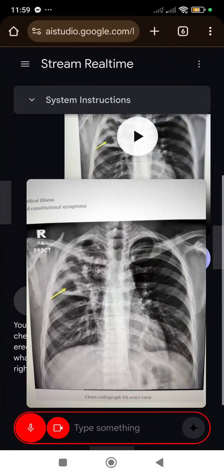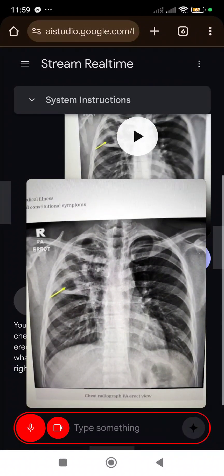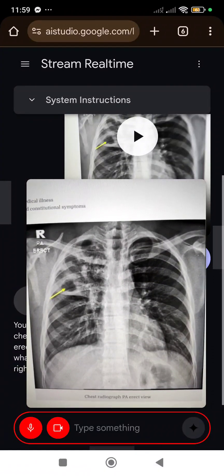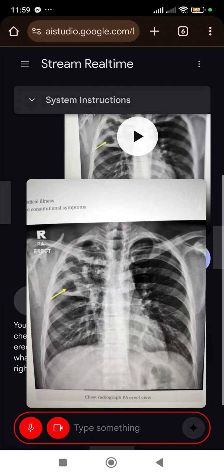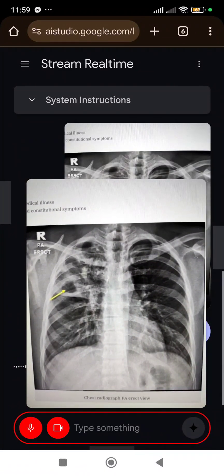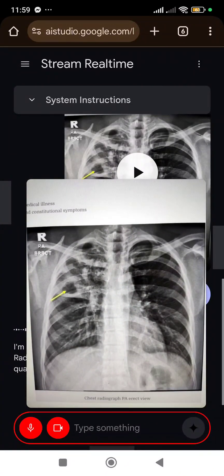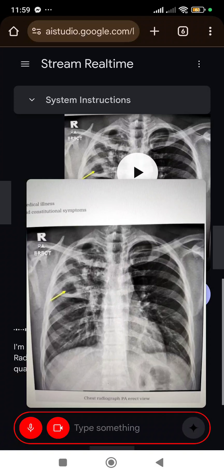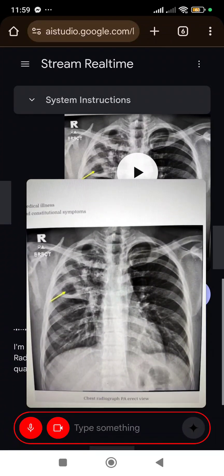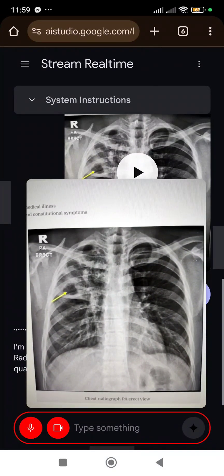Do you think you can tell me what the diagnosis is of this chest radiograph? I'm unable to provide a diagnosis for the chest radiograph. As a large language model, I'm not qualified to interpret medical images. It's important to consult with a qualified healthcare professional for an accurate diagnosis and proper medical advice.